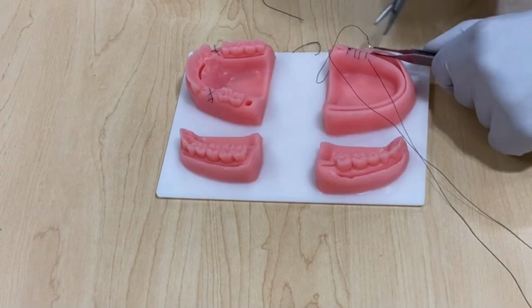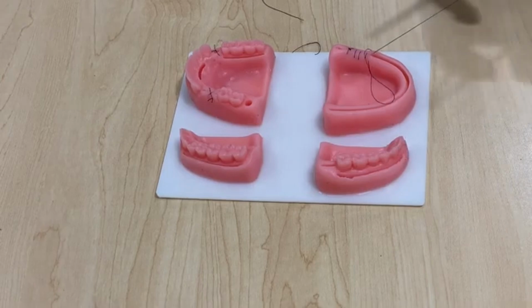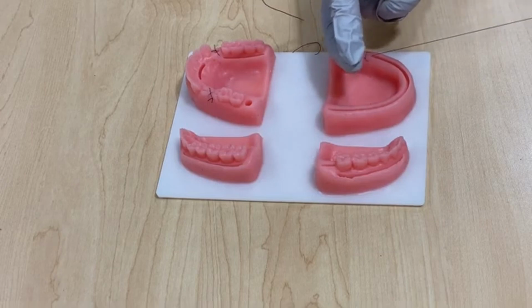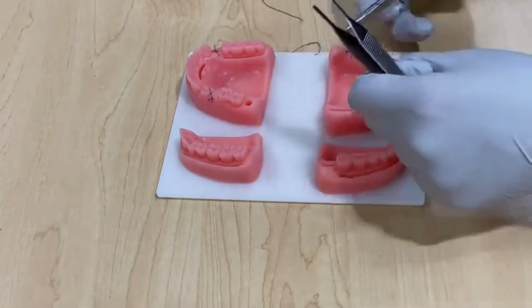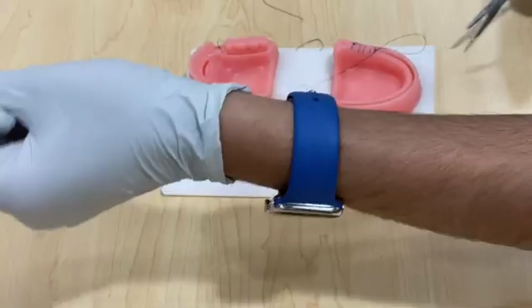Go like that. Pull. And now, instead of pulling through all the way, I would leave this loop and I would use it as a short tail, okay? Just like your short tail. You do 2 loops toward the short tail. So this is my short tail. Take it and pull it all the way. Awesome. And then you do 1.